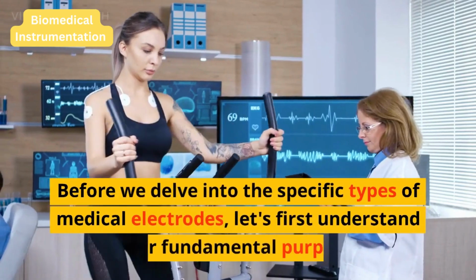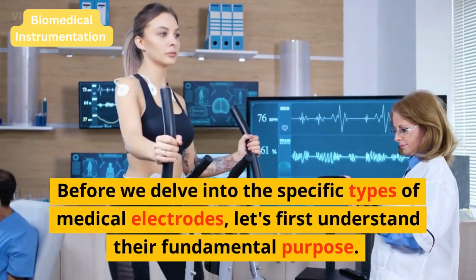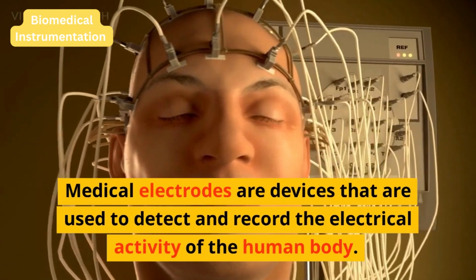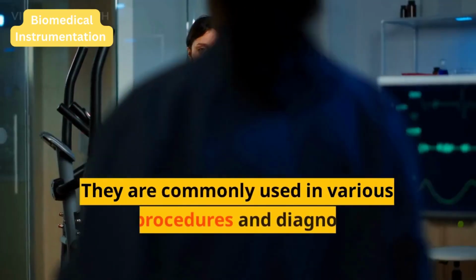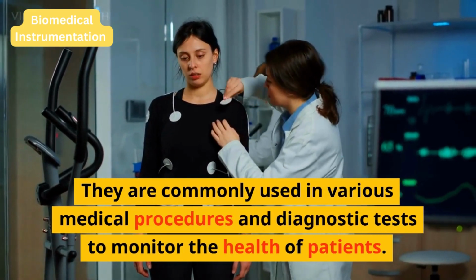Before we delve into the specific types of medical electrodes, let's first understand their fundamental purpose. Medical electrodes are devices that are used to detect and record the electrical activity of the human body. They are commonly used in various medical procedures and diagnostic tests to monitor the health of patients.